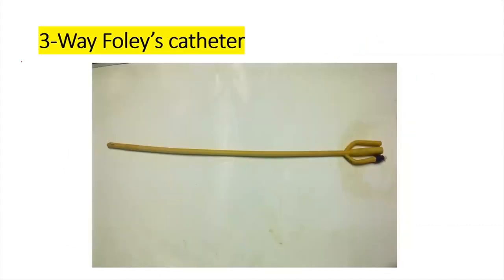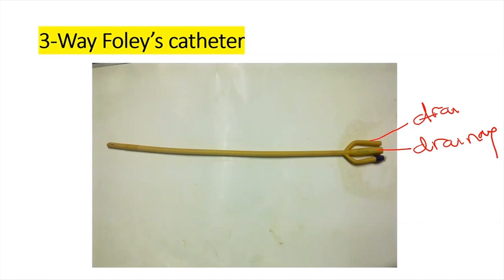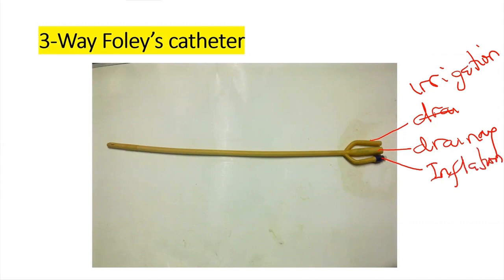This image shows a three-way catheter. The three-way catheter has three channels. It has one funnel each for drainage, irrigation, and inflating the balloon. This is the shaft, and this is the eye and the tip of the catheter.